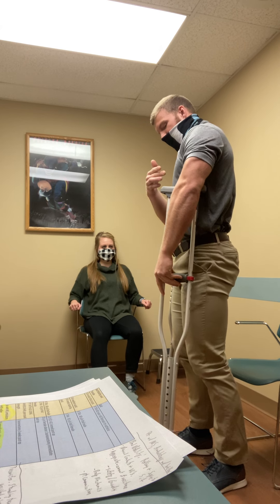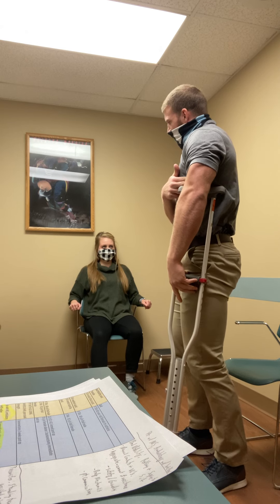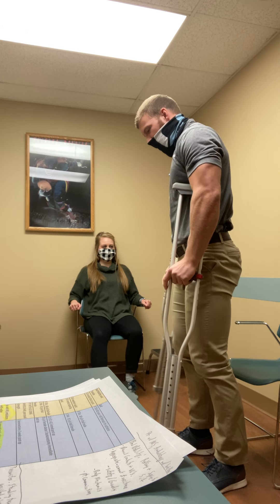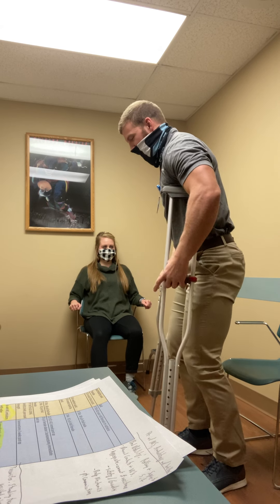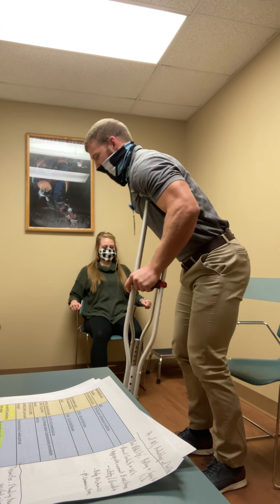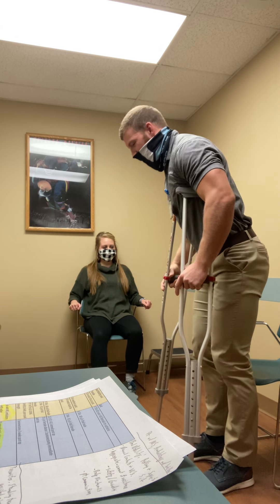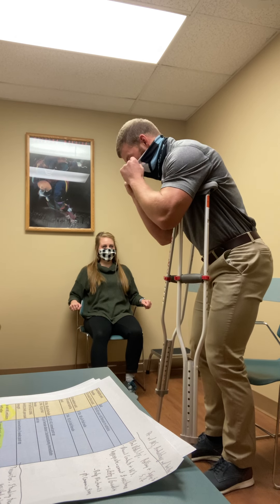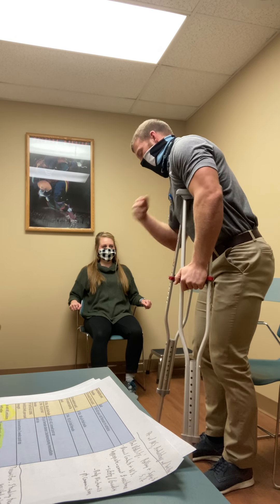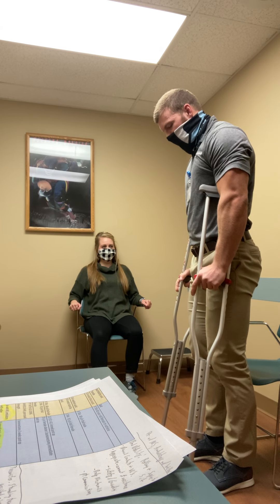You want to make sure that your axilla and the pad are about two inches apart. When you start walking, you want the weight through the hands. You don't want to be resting like this because that causes compression — we don't want any neurovascular compression, any sort of numbness or tingling going down the arms. That means you're most likely putting too much weight through the armpits. So weight through the hands — that's a big thing.